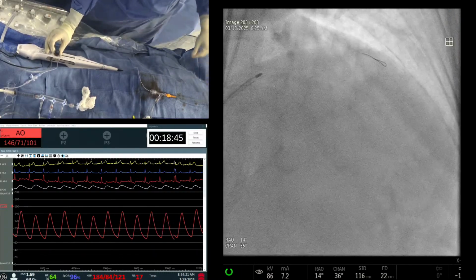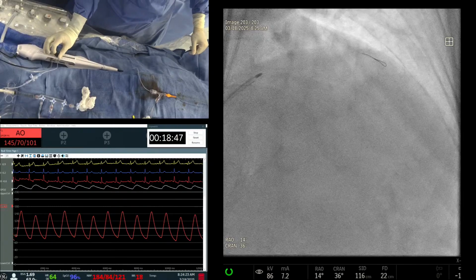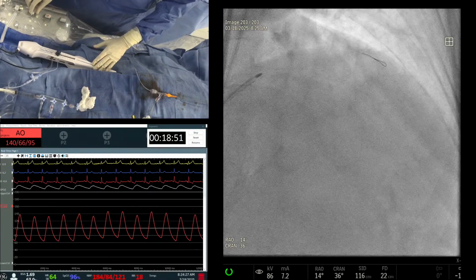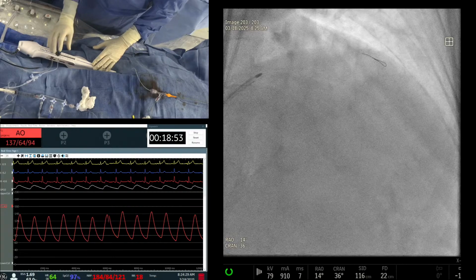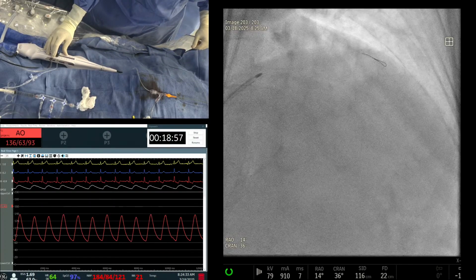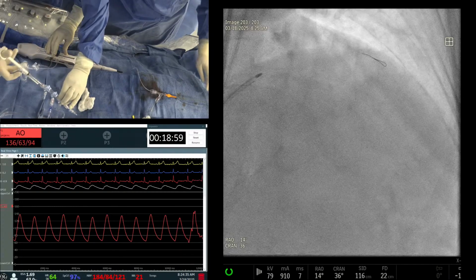The same thing. So much calcium, and going then to the distal. Speed dependent. Should we go one to five? No, let's take a picture. I think you have a very short lesion. You want me to take one picture? Could be wire bias. Let's see.